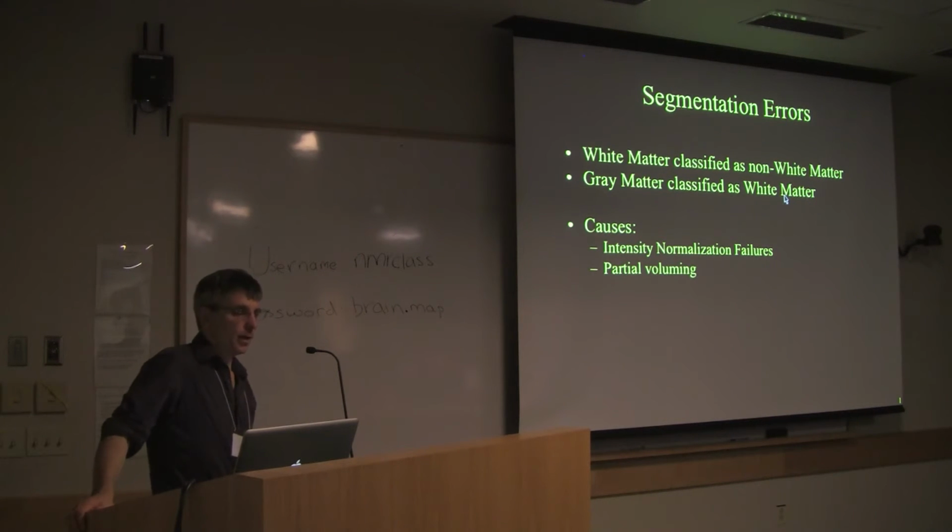So that was the first type of error, the skull strip. The skull strip is either going to remove too much or it's not going to remove enough. And if it removes too much, then you clone. If it doesn't remove enough, then you erase.